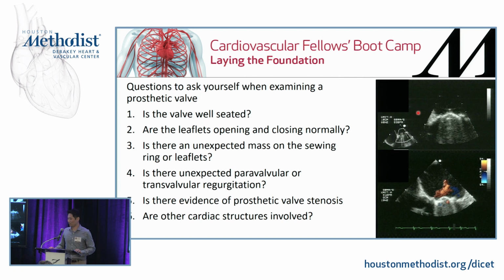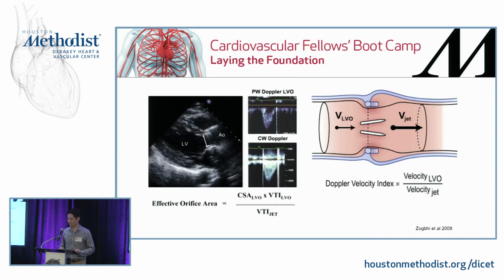There's no mass on the sewing ring, so you would take your time looking at everything. There's no paravalvular leak. You can see the washing jets, so there's expected transvalvular regurgitation. And finally, you would look at a Doppler and evaluate for stenosis and look at everything else.